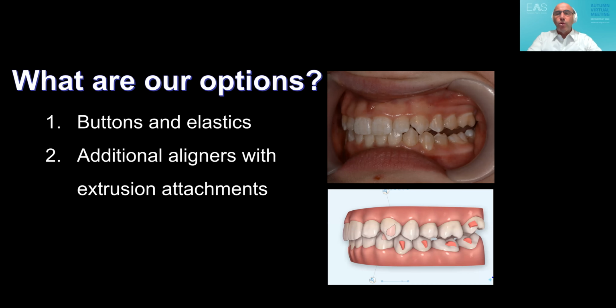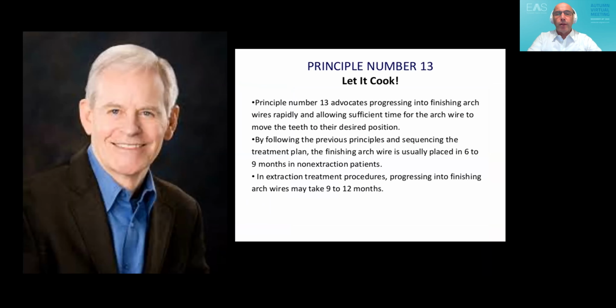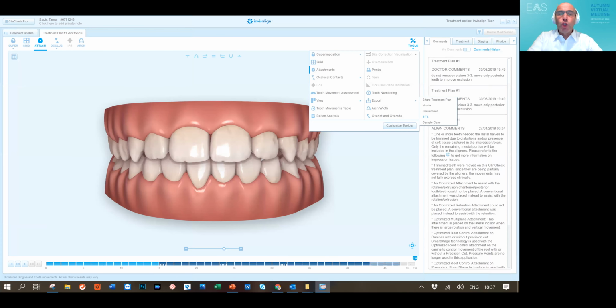But I've chosen to do something completely different. I've chosen to use my mentor Wick Alexander's principles, one of which is let it cook. Remember that in your ClinCheck, we had a very good occlusion, not only in the front, but also in the back. So here is another tip for you.